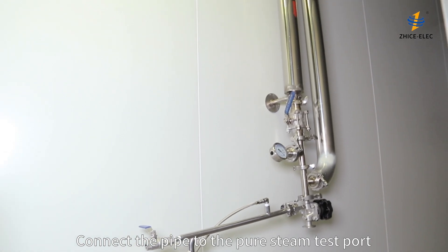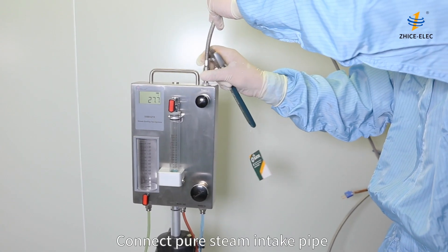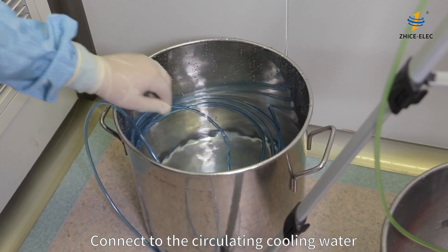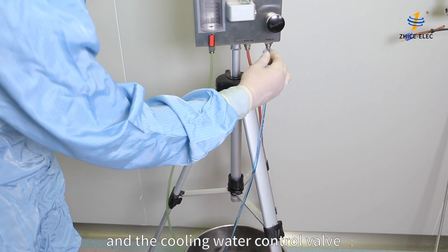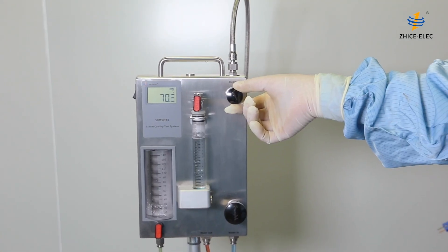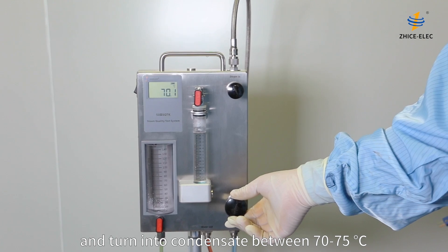Connect the pipe to the pure steam test port. Connect the pure steam intake pipe to the non-condensable gas test unit. Connect to the circulating cooling water. Adjust the steam control valve and the cooling water control valve, and let the pure steam enter the non-condensable gas test device and turn into condensate between 70 to 75 degrees Celsius.